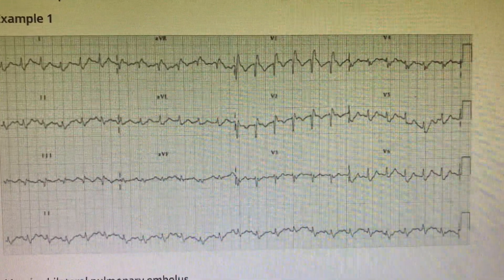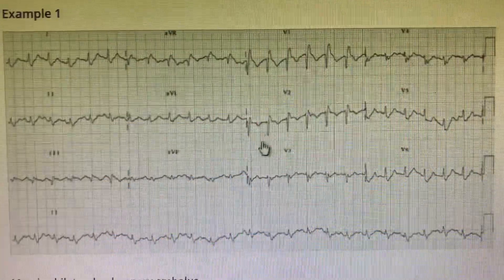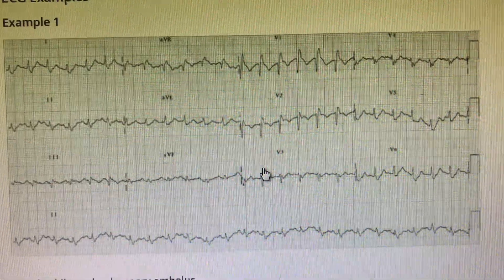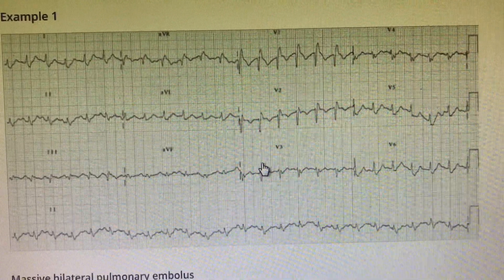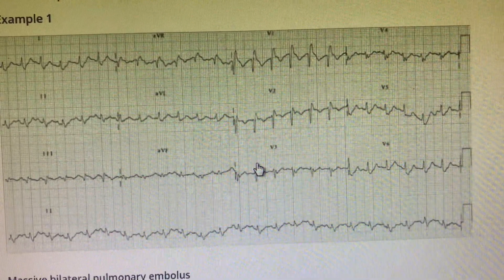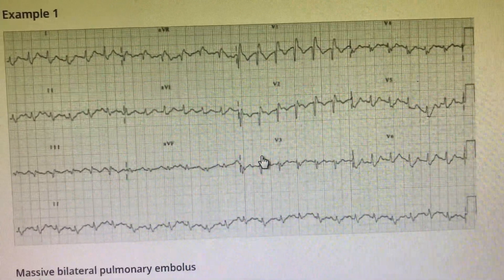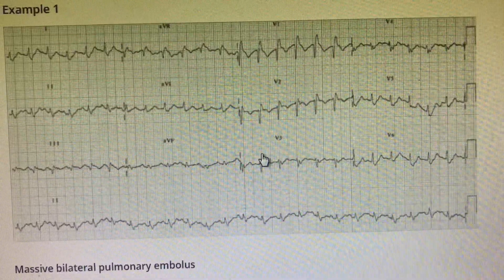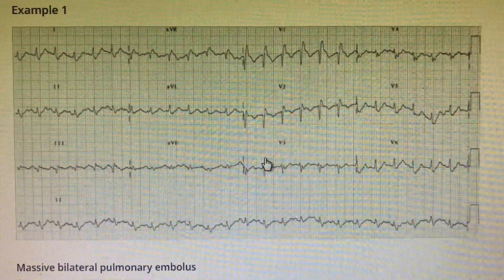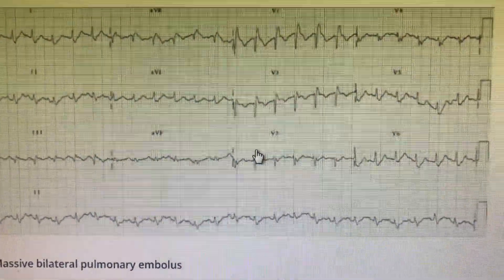We are considering pulmonary embolism as a differential diagnosis of Wellens syndrome because there is T wave inversion in V1, V2, almost up to V3. When considering it with the strain pattern, tachycardia is present, AVR elevation is there — very important — and there are slight changes in leads 2, 3, and AVF also. Because it is acute pulmonary embolism, there is acute hypokinesis of the RV wall, so the ECG changes are more regarding that.